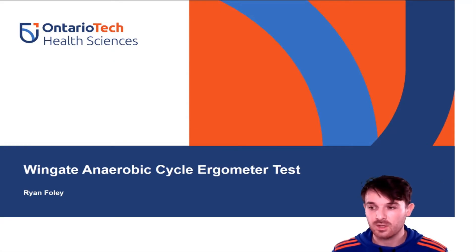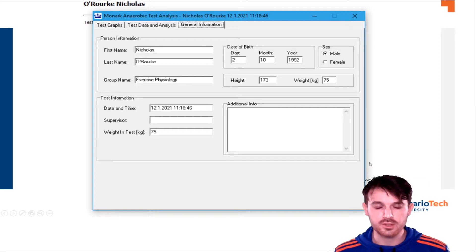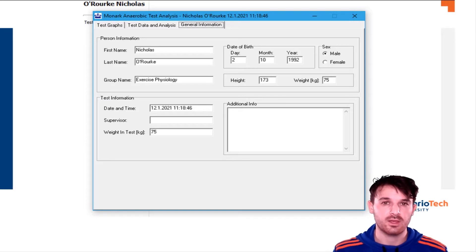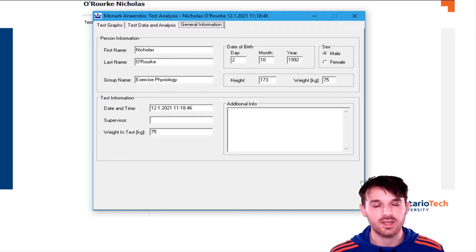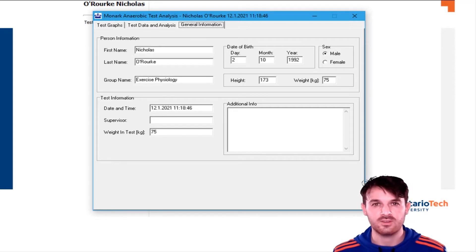The first thing you're going to need to put into our software is the participant's weight. We put them in by name and weight, categorize by class, and you definitely need to know if they're male or female if you want to compare to normative data later. Having their birth date also helps because some of the normative data is stratified by age.